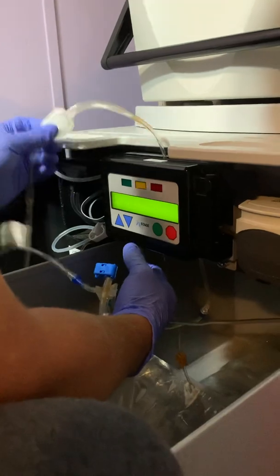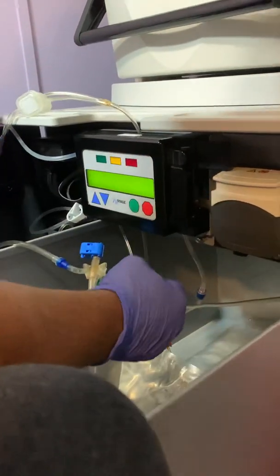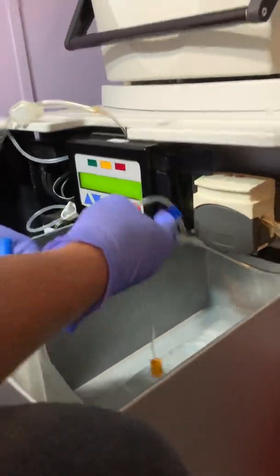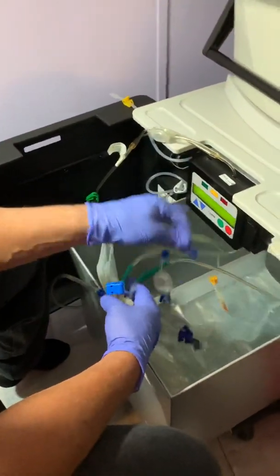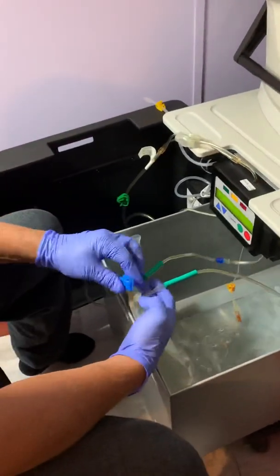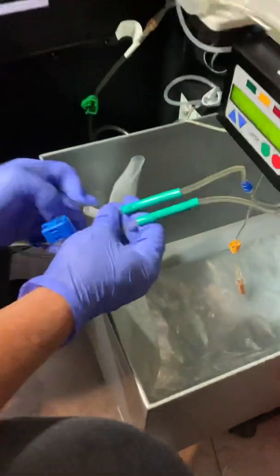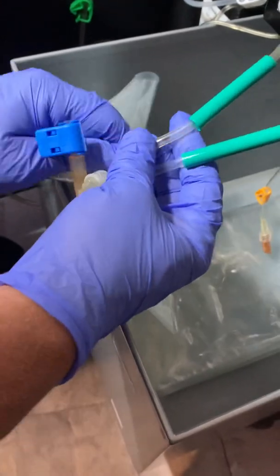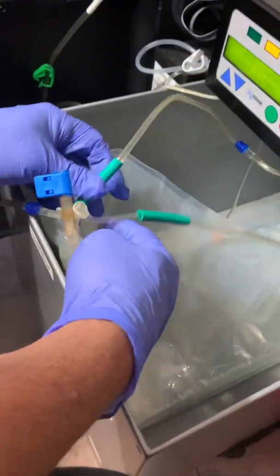Once it's closed it'll tell you to connect the lines. When we connect the lines, there's a few lines that have to be connected. The first one I do is I take these things — you gotta slide these little clips off. Just straighten out the lines. You can slide this green piece all the way down so it covers them and keeps it open.